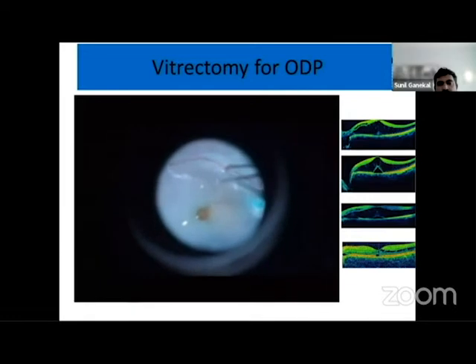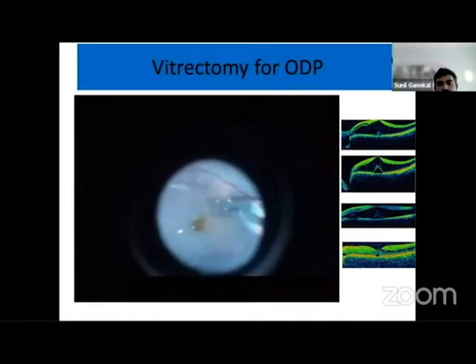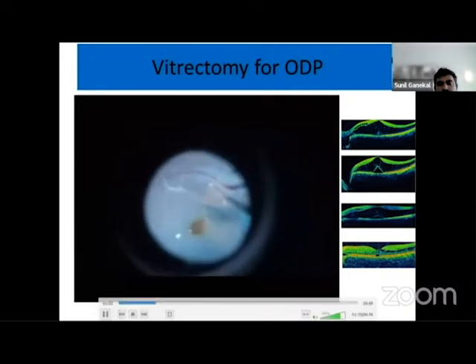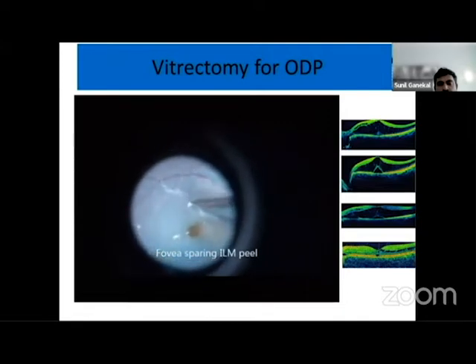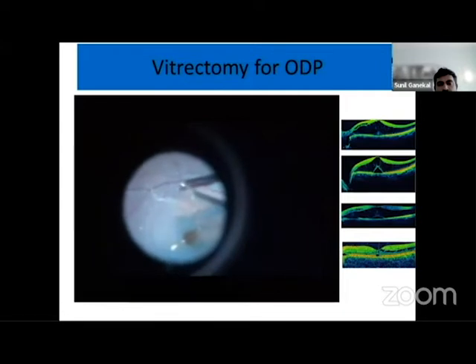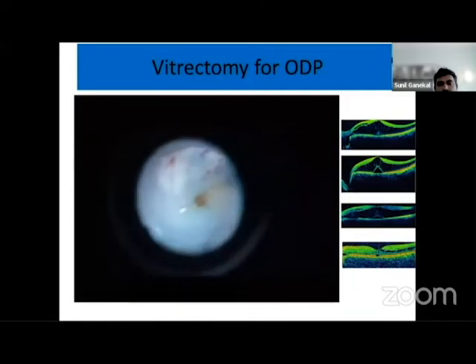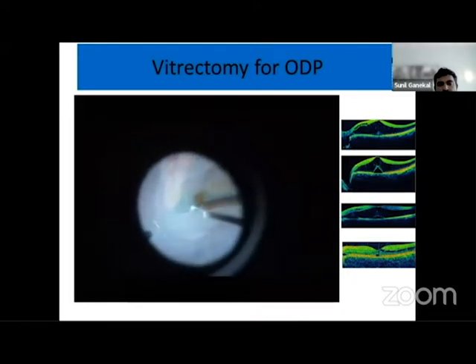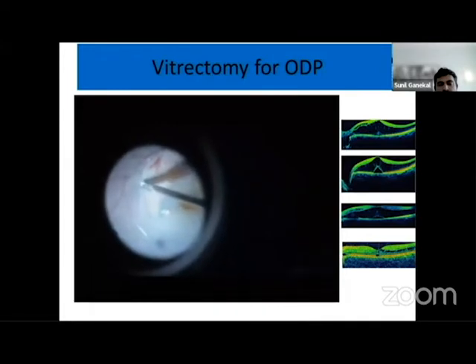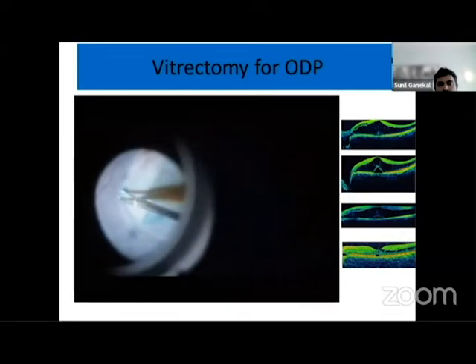If the fovea is grossly cystic, it is preferable to do a foveal sparing ILM peeling. Grasp the ILM by the pinch and peel technique. You can slowly and gently peel the ILM. ILM peeling can be done up to the arcades, similar to the way you do it for a macular hole. So here is the continuation of the ILM peel and enlargement of the peel to the extent possible. Continue enlarging the ILM peel.